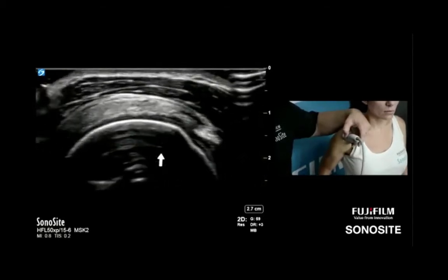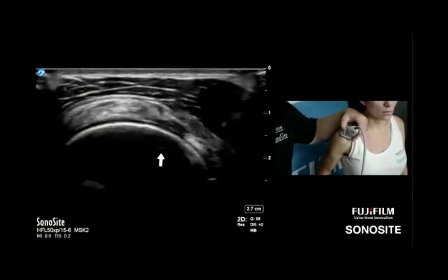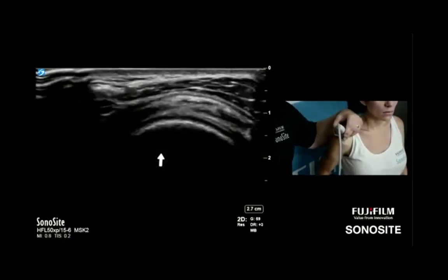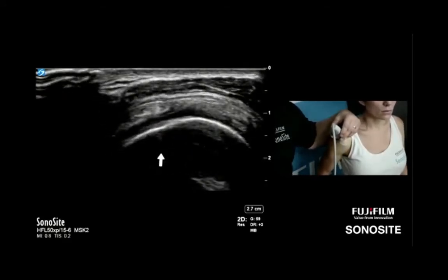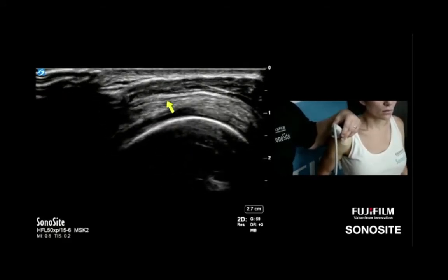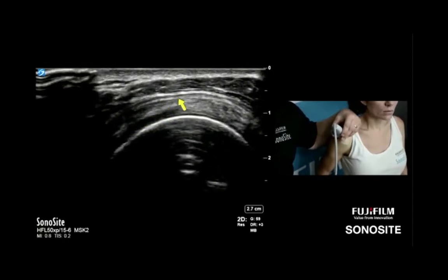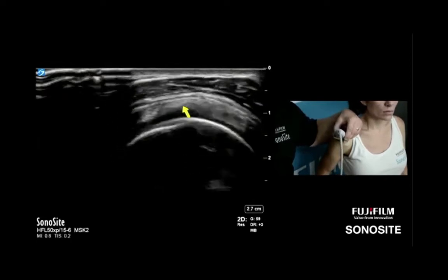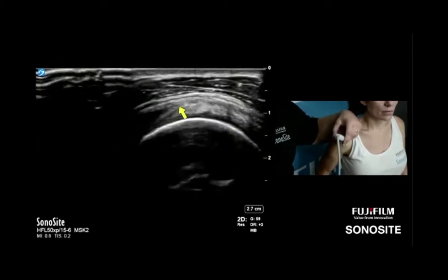Bill asks Daniel to work more proximally over the humeral head to show the oblique line where the infraspinatus overrides the supraspinatus. Daniel demonstrates: there it is — right there. When you're more proximal, that's what you're looking for to distinguish infraspinatus from supraspinatus.